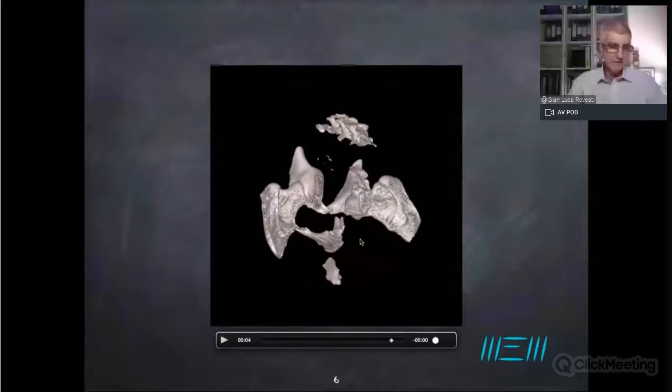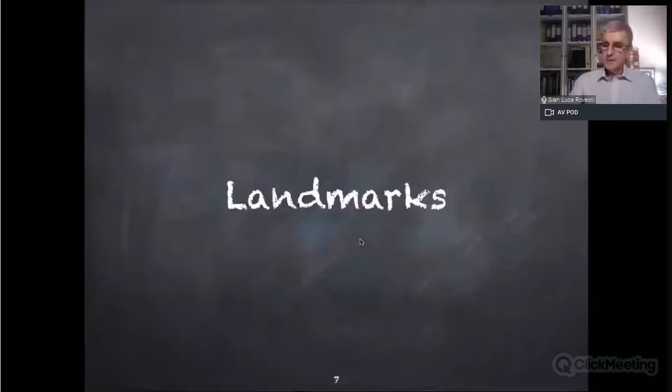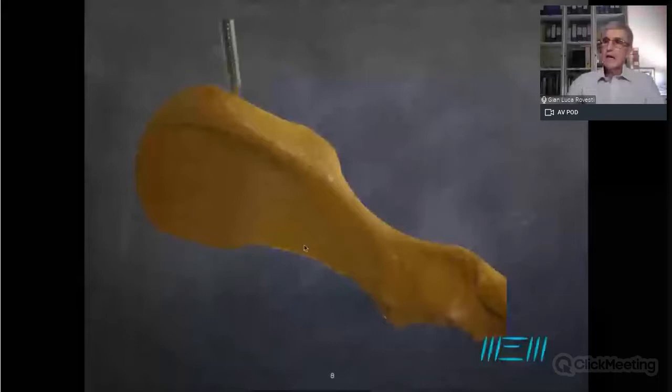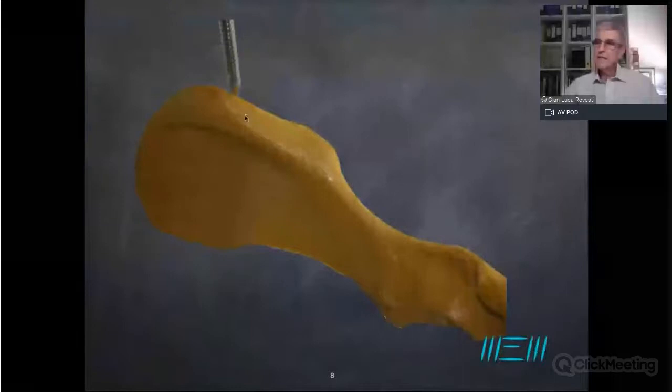So if we decide to use the external fixation, we need the landmarks that we should use in order to put our fixator. And they are quite simple, because on the iliac part of the pelvis, we have the crest of the iliac wing, the dorsal crest, that is a very easy and straightforward landmark to palpate and to identify. So no problems at all in identifying this landmark.